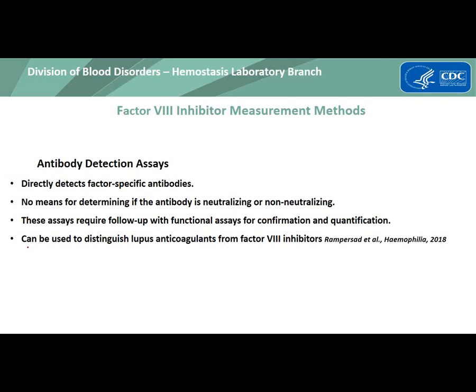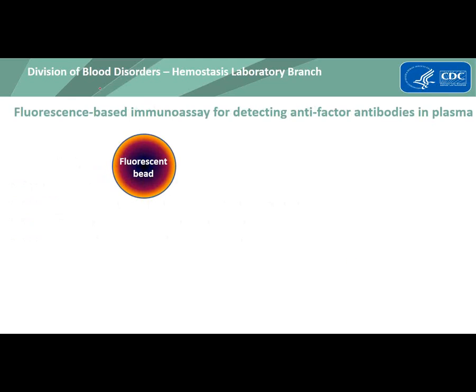And then I'll add that antibody detection assays can also be used to distinguish lupus anticoagulants from factor VIII inhibitors. And this was described in a recent paper by Dr. Rampersad at Indiana Hemophilia Treatment Center, in which members of our hemostasis laboratory branch were collaborators.